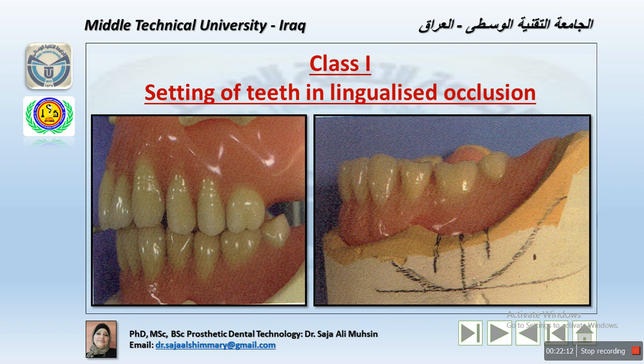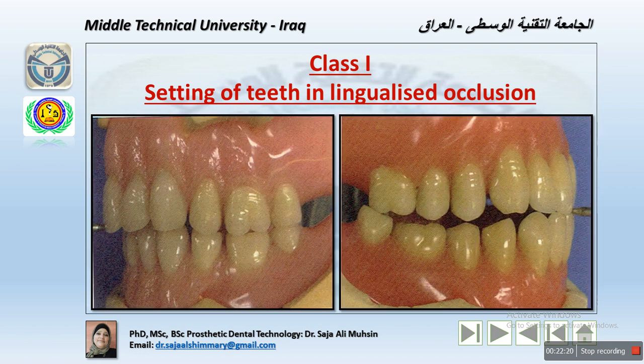Okay, as in the image on the right side. Now, as I previously mentioned, the arrangement of the teeth can often lead to fewer posterior teeth being placed compared to the natural occlusion. There are a number of options that can be employed in these circumstances.